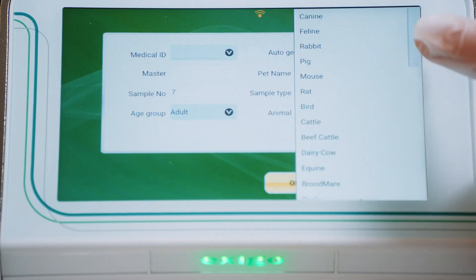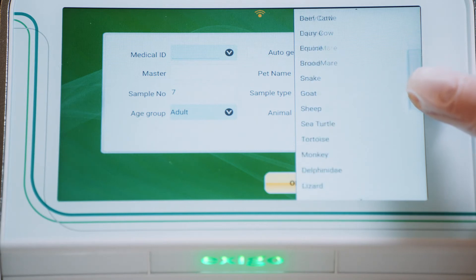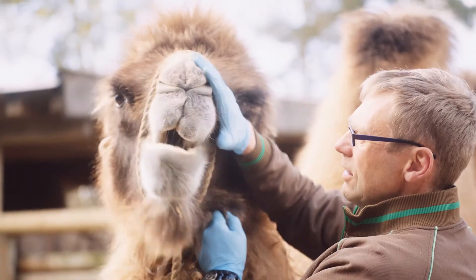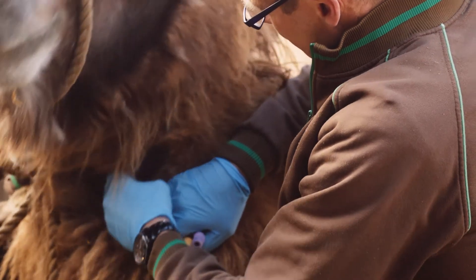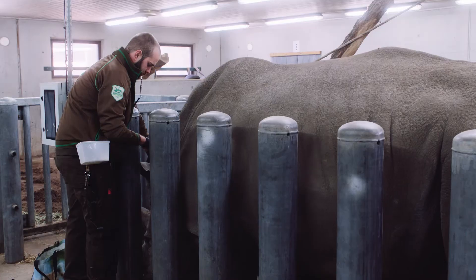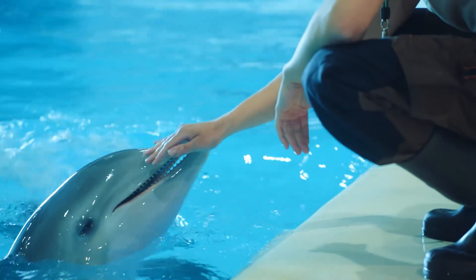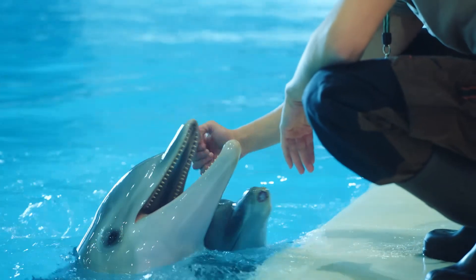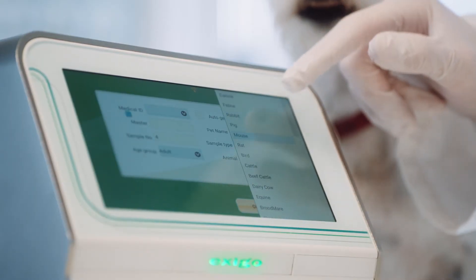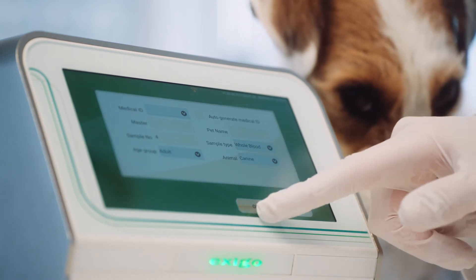With more than 25 pre-installed animal profiles, Exegos C200 enables mobile practitioners, research facilities, pharmaceutical companies, and veterinary clinics treating anything from companion animals to exotic animals to experience the benefits of a cost-effective, simple, and high-quality chemistry analyzer. It is also easy to add more animal profiles, if needed, through the intuitive touchscreen and easy-to-use user interface.